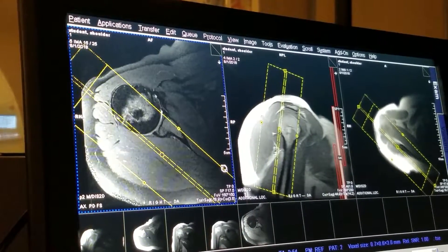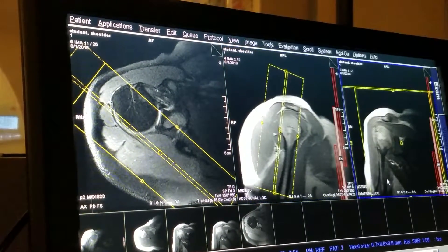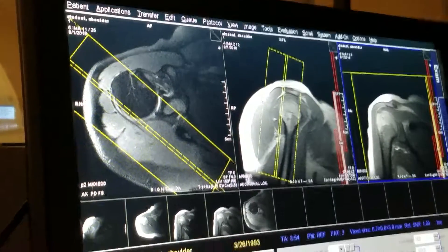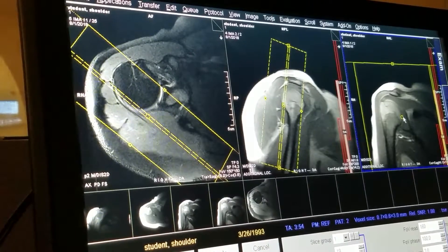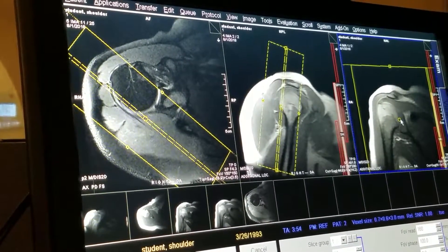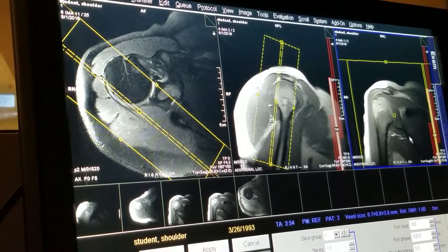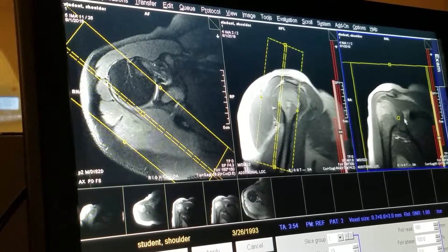Once I angle parallel to the supraspinatus tendon, I'm going to come here and bring up my coronal localizer. My field of view — I'm going to position right in the middle of the shoulder joint. Now, depending on what machine you're on will determine what size field of view you're using. Sixteen field of view for someone her size — I have plenty of anatomy covering within my field of view.